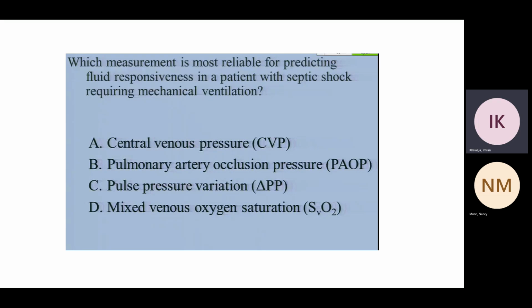Dr. Zeid asked about the answer options. Why did they put it in here, and how does it relate? In hypovolemic shock, the mixed venous is low. To differentiate cardiogenic from hypovolemic, the mixed venous is low. It's a surrogate for cardiac output in someone with cardiogenic shock, and it would be low.